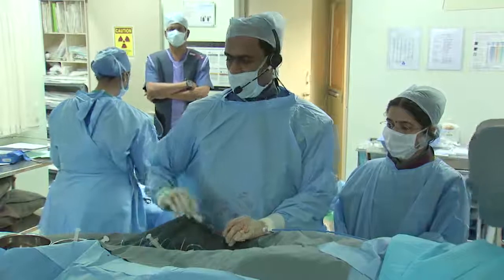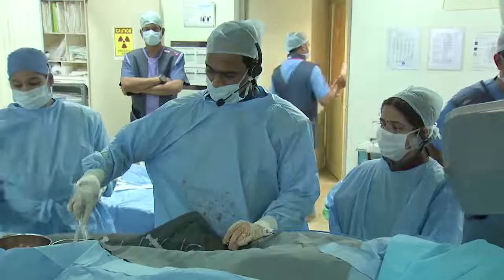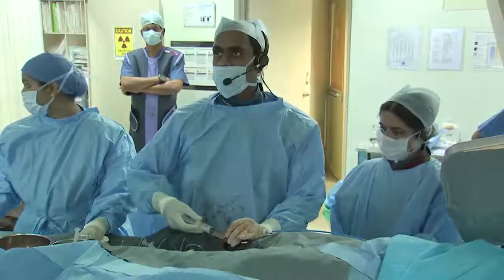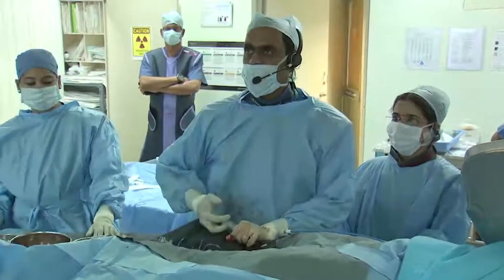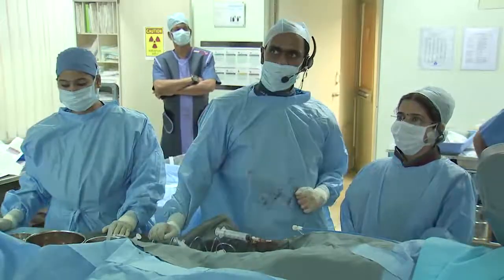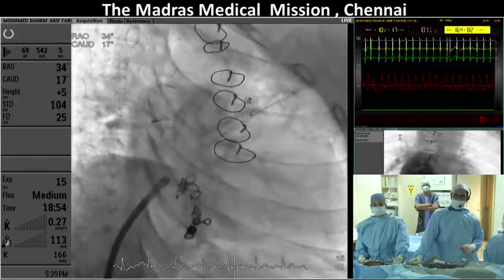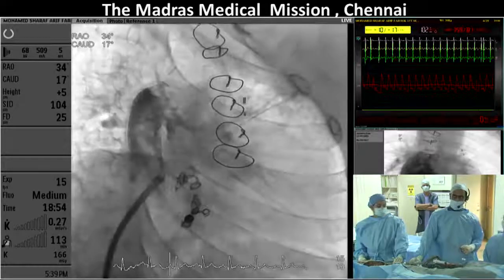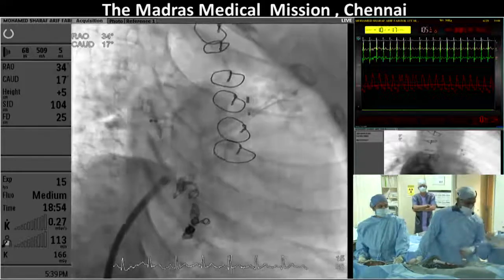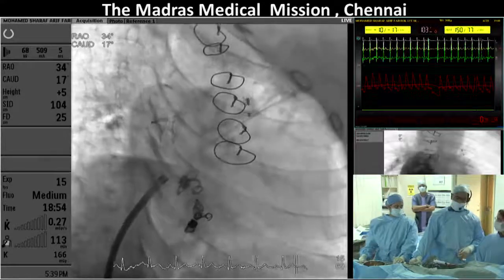Okay, excuse me, just before going to Frankfurt, for those who do not have this kind of device, is it possible to use a homemade fenestration? I mean, just opening the device with any dilator or things like that, for those who do not have such a device? Well, I did that quite a lot with the old Starflexes and CardioSeals. We probably put in 30 or 40 of those devices. I think it's harder to do with a wire mesh device. It's much easier to do with a device that closes mostly with fabric.